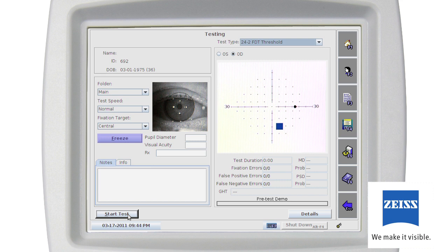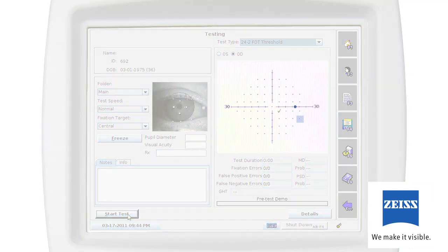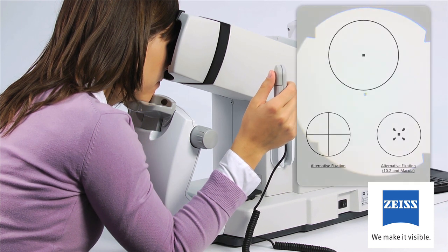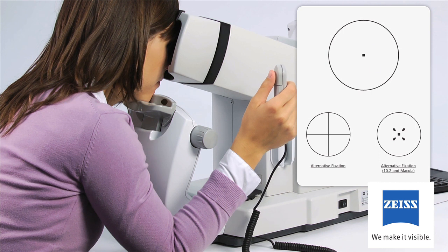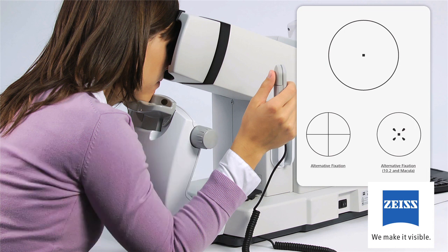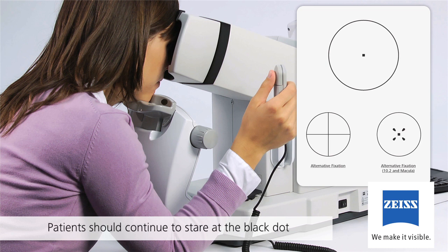The patient's pupil should be kept inside the circle on the video image for proper alignment throughout the test. A freeze button allows you to freeze the image. One millimeter tick marks on the eye display box allow you to estimate pupil diameter if desired. Pupil diameters less than three millimeters may require dilation. Once the patient is properly aligned, explain that a demonstration of the test is running. The patient will need to continue to stare at the black dot in the center throughout the test. Whenever the patient sees a pattern that flickers, shimmers, or is striped in any area of the screen, they should momentarily press the response button once.